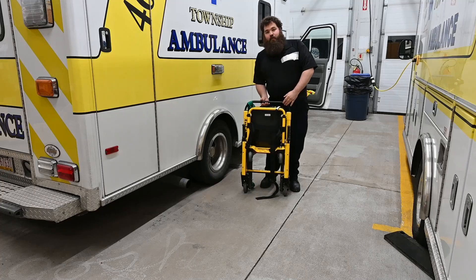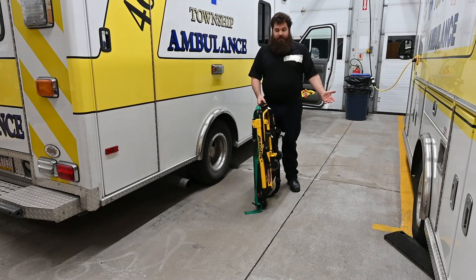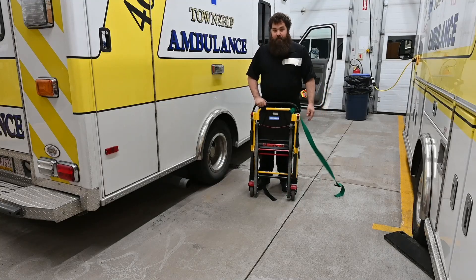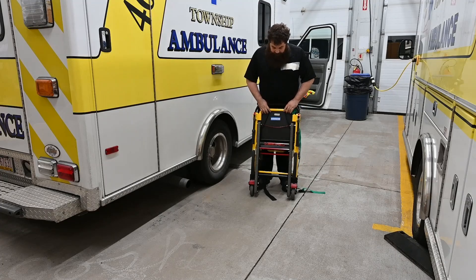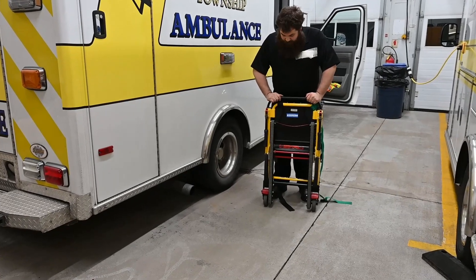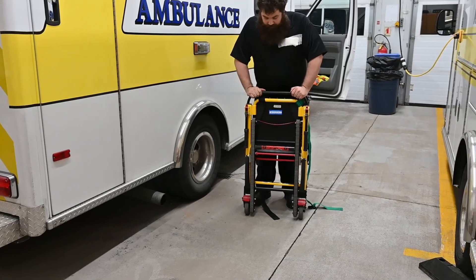Basically when it's folded up in the truck, it folds up just like this. There are some blocks on the back to keep it from rolling away, and a whole bunch of different red handles for various functions. We'll be going over each one of those as we continue on here tonight.